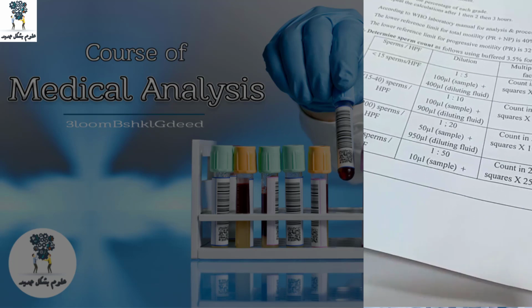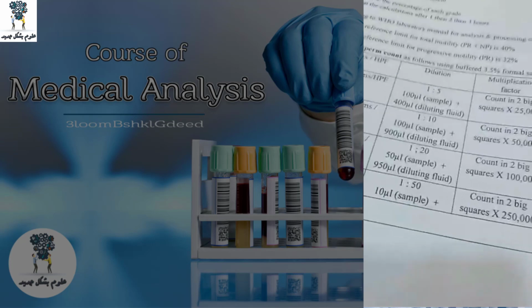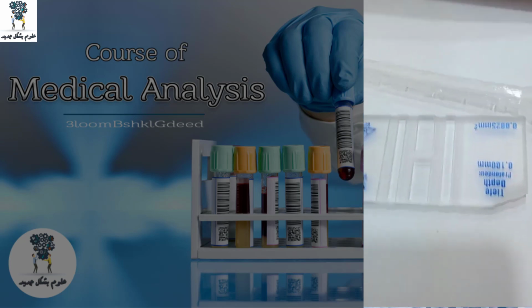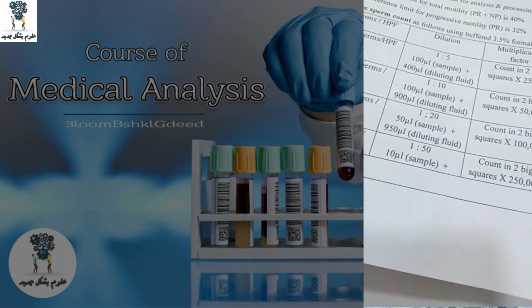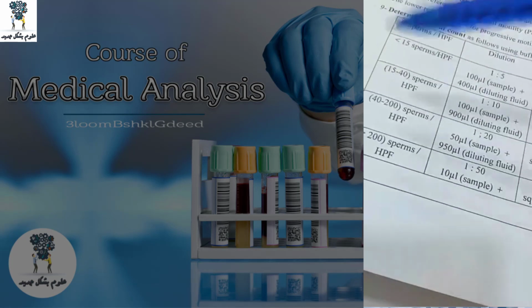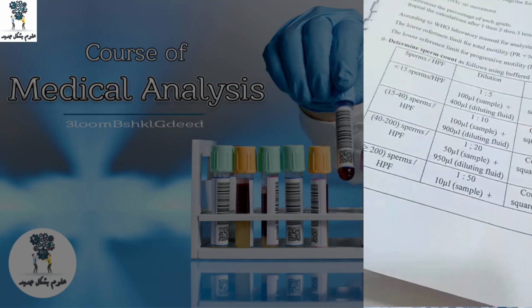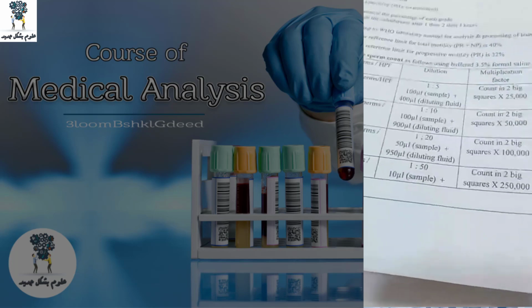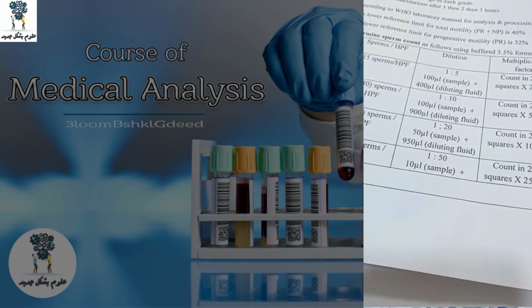After dilution, we have the next step, which is the count step, using this slide. It's called the count slide. What will we do? We will make the dilution according to our case, based on what you saw in the first step.